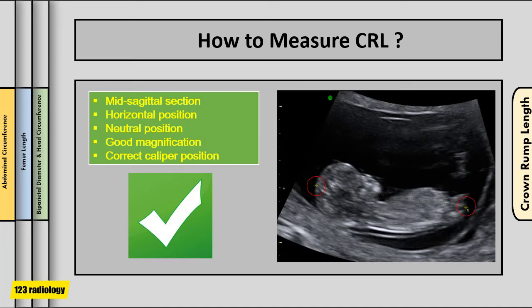This is an example of correct crown rump length measurement. As you can see, this is a mid-sagittal section of the fetus; the fetus is in a horizontal and neutral position, there is good magnification so you can clearly see the ends of the fetus, and the calipers are correctly placed — giving an accurate estimation of crown rump length.